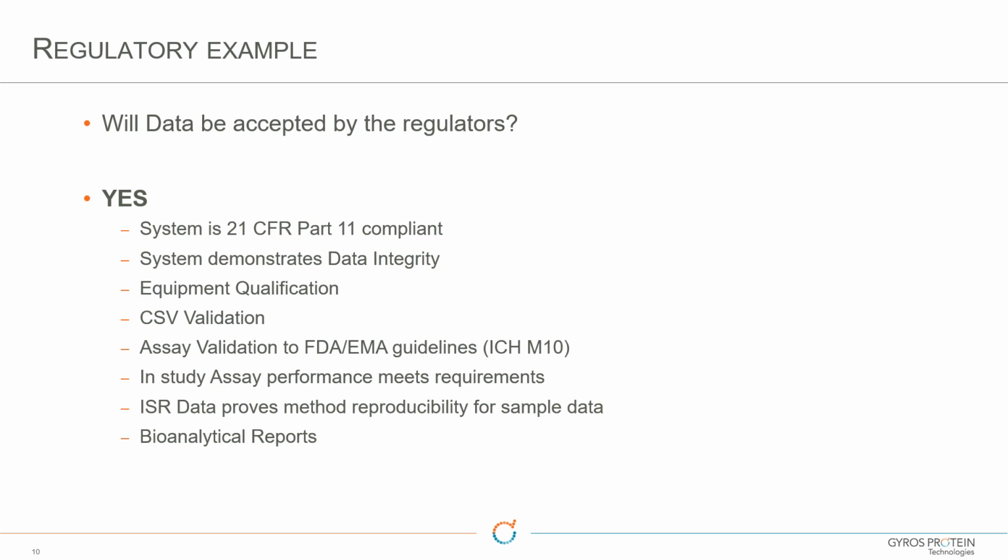And also, particularly for pharmacokinetic assays, you should do incurred sample reanalysis. So you do a certain number of reanalysis of the samples, normally 10% or 5% depending on the size of your study. And you should look at the data and summarize the performance of the assay in a bioanalytical report, or even for a biomarker report. So it's important that everything is well documented and that you follow full good scientific principles.